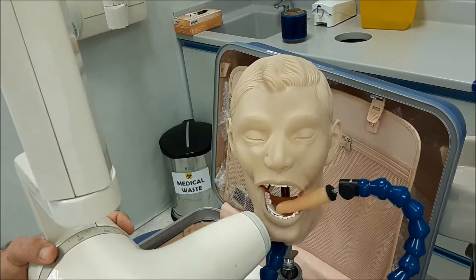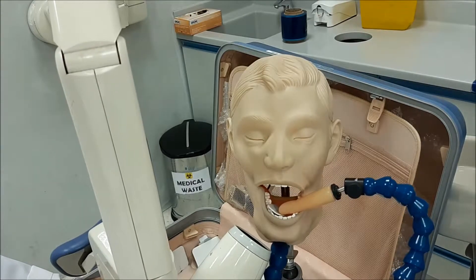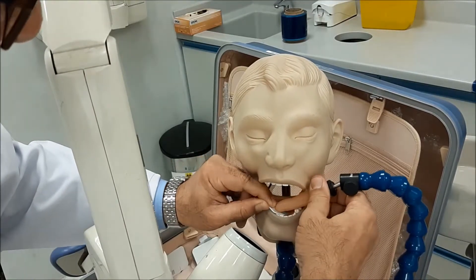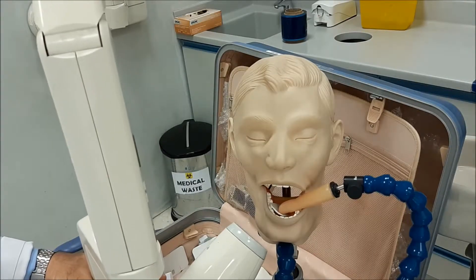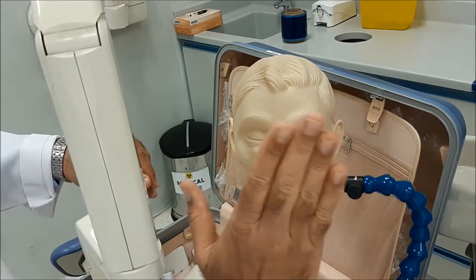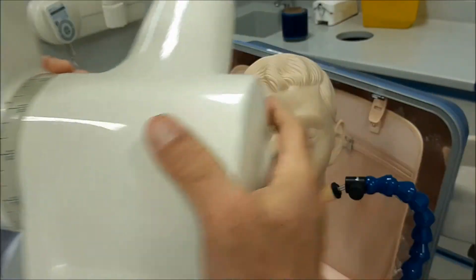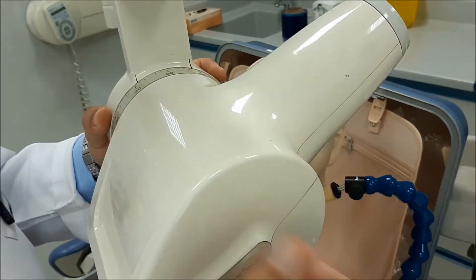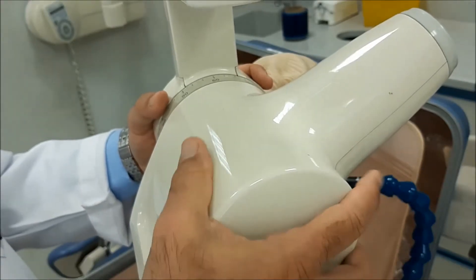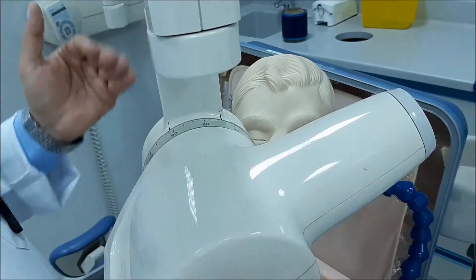Next, adjust the vertical angulation. This is done by first directing the beam perpendicular to the tooth, then directing the beam perpendicular to the sensor, and finally redirecting the cone to be perpendicular to the bisector of the angle between the tooth and the film. By doing so, you get an angle of approximately minus 30 degrees. Since we're working in the lower jaw, the film position may differ from one patient to another, so this angle will differ. Follow the principle of perpendicular to tooth, perpendicular to film, and bisect between those two extremes.